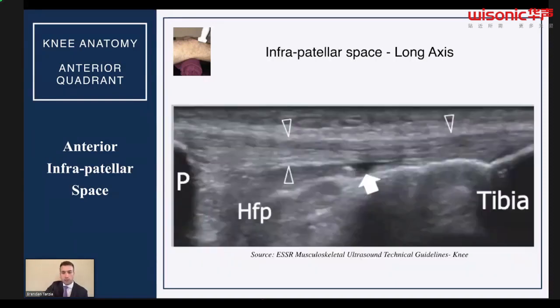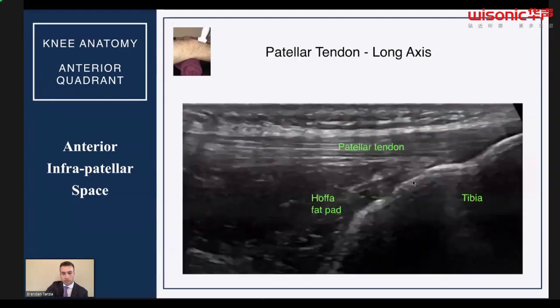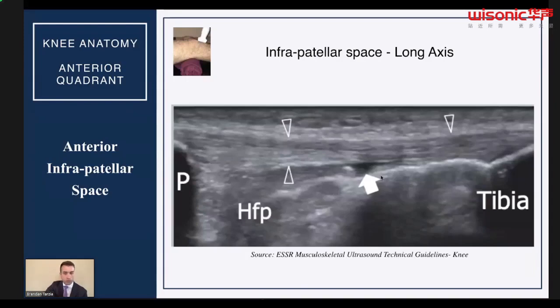because if we go back to this image, we don't see that deep bursa right there. We don't see it where it should be. But this is a good image of looking more at that bursa.